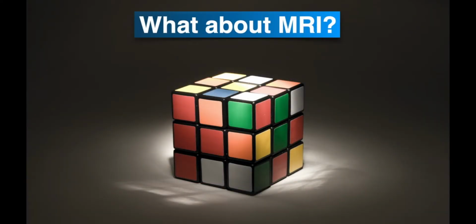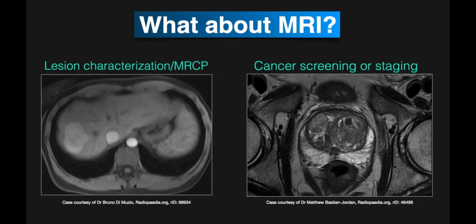Now, how might we consider the relationship between MRI and CT? When I recommend an MRI, I like to think of a specific question or imaging puzzle that I'm hoping to solve, and that is because each exam is tailored to best evaluate different anatomic regions and pathology. There's no single phase workhorse for MRI like we have in CT. You need to come to the table with a specific question.